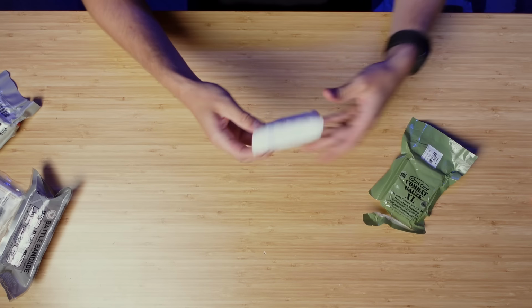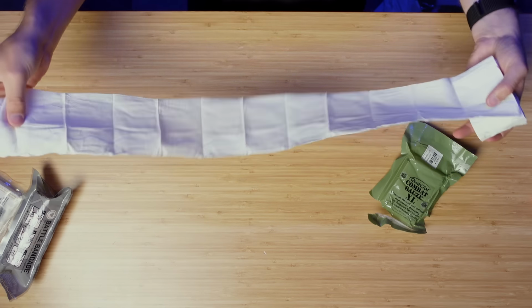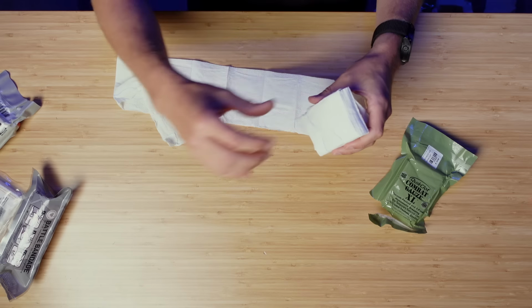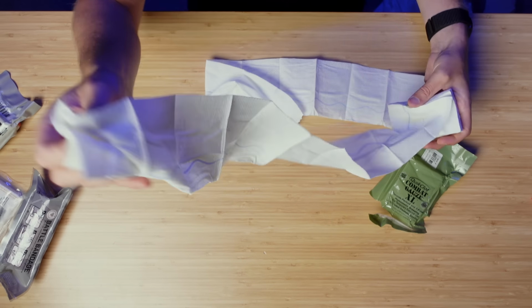So it pops out of the bottom here, and it is all Z-folded. So I can just keep on pulling this. It's not spinning in my hand. It's not going all over the place, which I really like about Z-folded versions. And then this is just packed into the wound. Pretty easy to find the end of it, but if you can't find the end and you just grab this with your hand, you're going to get what you need to start packing that wound.